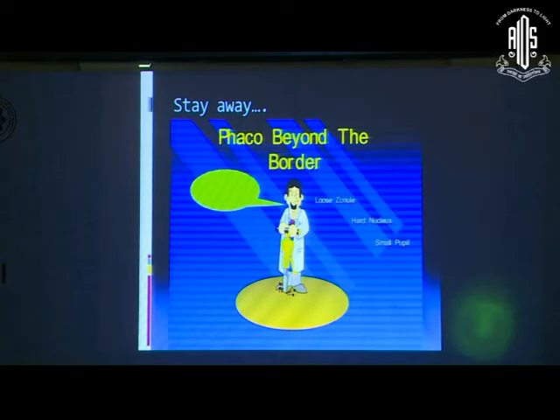So this was the basics of the machine, and the further steps will be told. But since this course is a Prarambhika, and I believe it is for beginners, although many of you must be experts, stay away from phaco in difficult situations, that is, loose zonules, hard nucleus, small pupil. Don't go into these at the beginning if you are going to begin phaco.